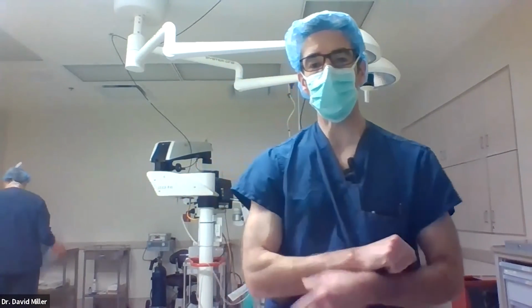Can perfluorocarbon liquids be left in the eye? Yes, you can. I have done that trick quite a few times, especially for giant retinal tears and some other cases. Not often, but enough to say that it works quite well. There are some people who use it in almost every giant retinal tear, and it can be very helpful. It's a nice reproducible way to repair some tougher detachments. You do have to go back and take it out. I think it's fairly well tolerated in the eye, at least up to a few weeks.